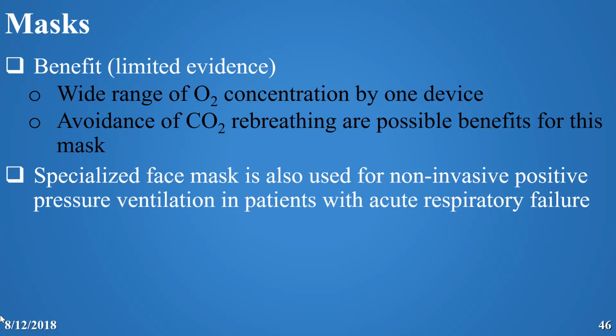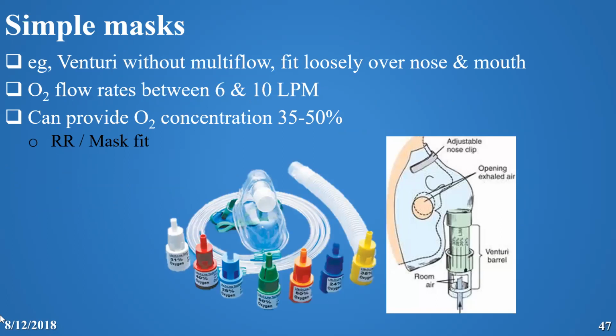The masks are of different types. They can be designed in a triangular shape. They can have a cushion or be without a cushion. The cushion can be water inflated or inflated by air. It can have an additional port for delivery of medications. This mask is made to give oxygen and to avoid respiratory failure as much as we can. The whole purpose is to avoid intubation or invasive ventilation.